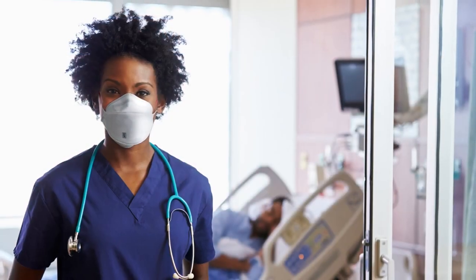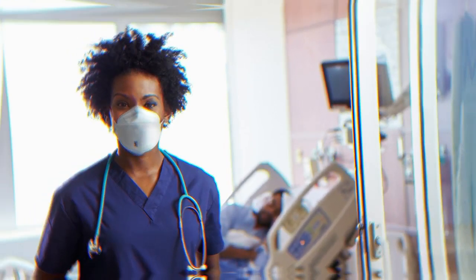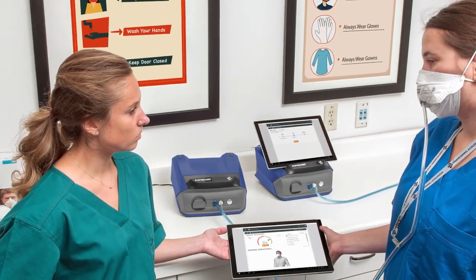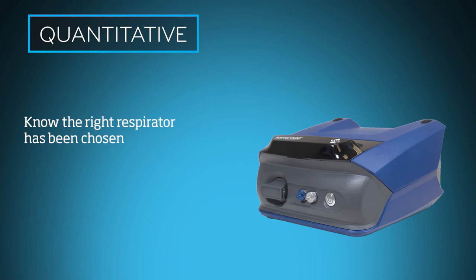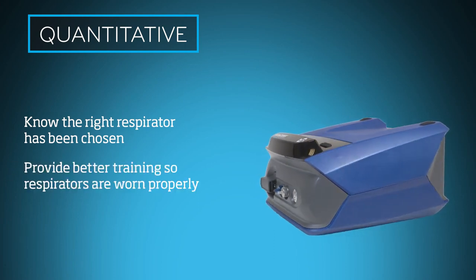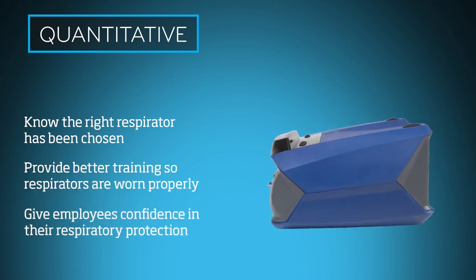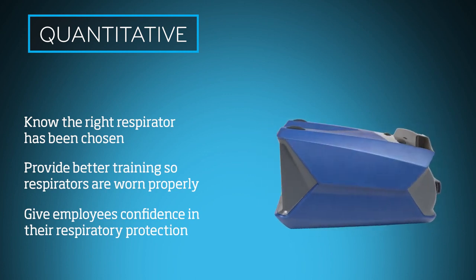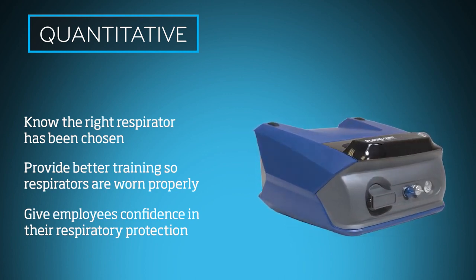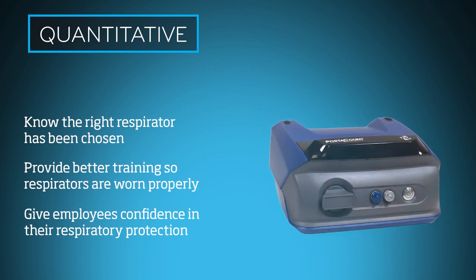But more importantly, for respirator wearers, quantitative fit testing with PortaCount instruments enables you to verify with data that the employees have been provided the right respirator, they know how to wear them, and that their respirators will provide protection to the level expected if worn properly. The PortaCount fit tester allows you and your employees to be confident in their fit and protection.